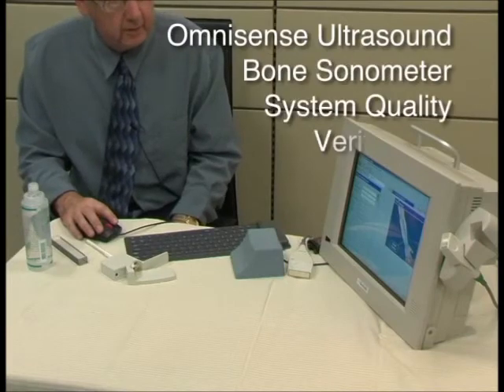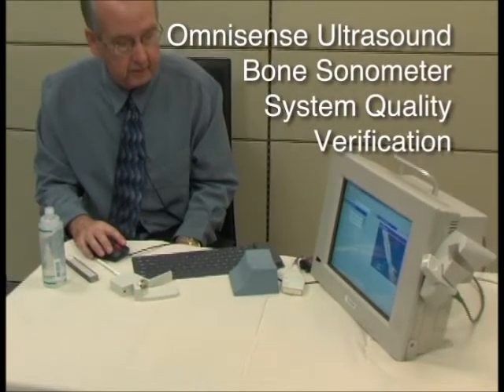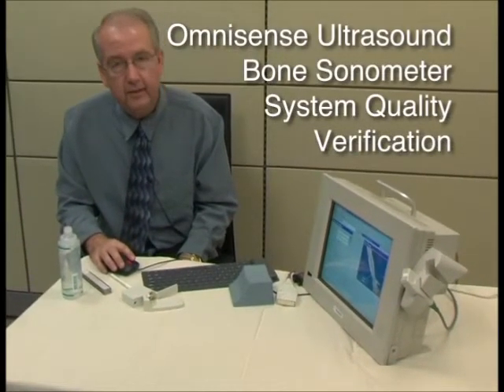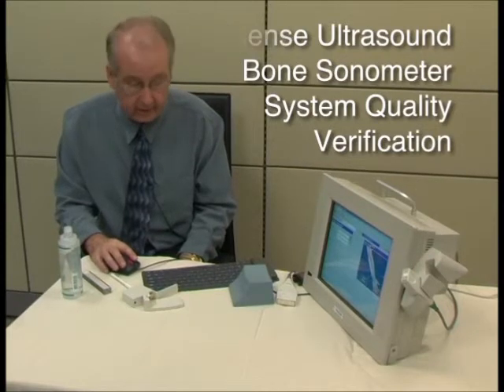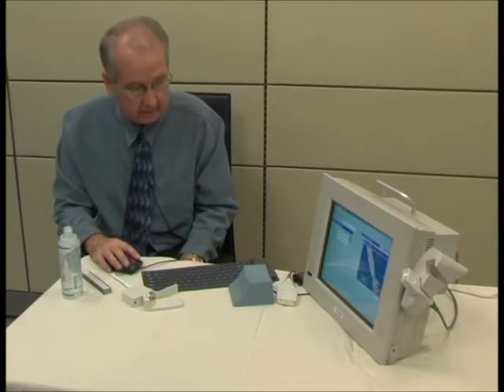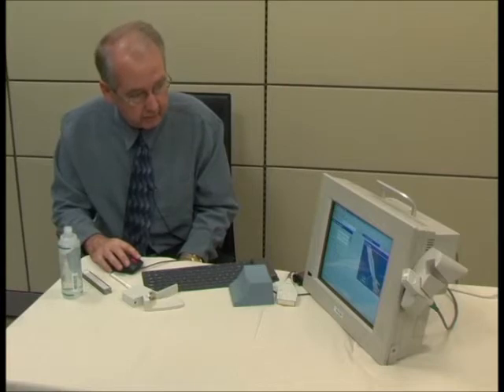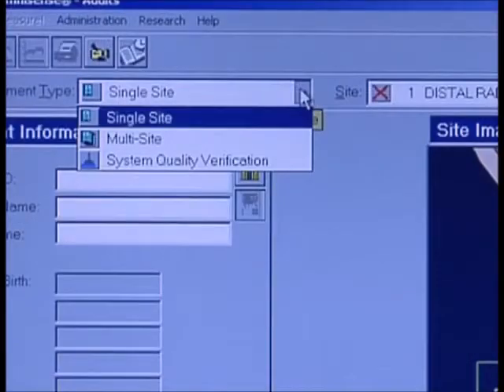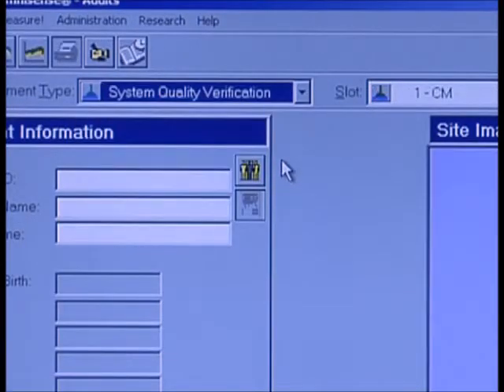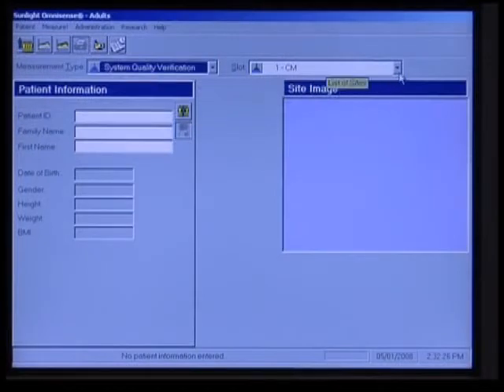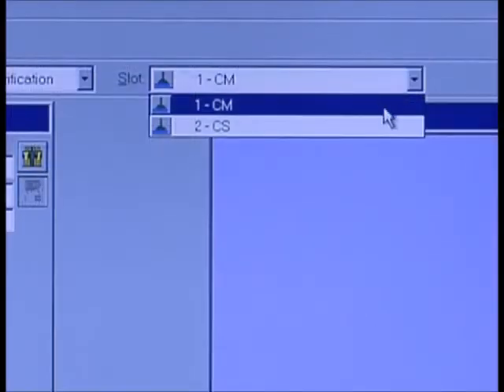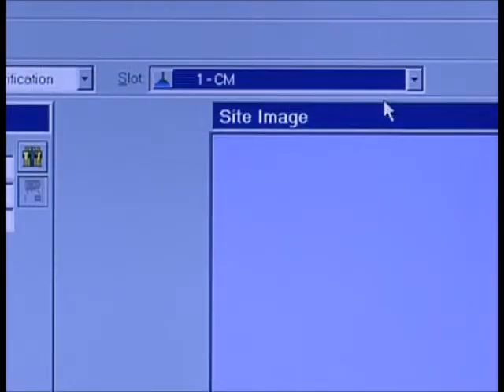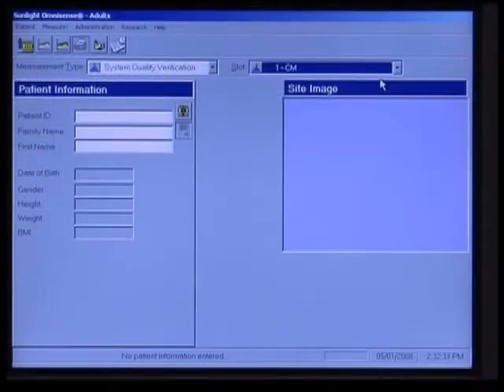Now let's perform a system quality verification, or SQV. Recall that we need to do this once a day, or else the machine is going to tell us that we have not done it. So we might as well do it when we first turn the unit on in the morning. Looking at measurement type, we need to make sure we click on System Quality Verification. We also want to make sure we're testing the correct probe — we want the CM because we're using the medium-sized probe for the radius. So we've selected CM.